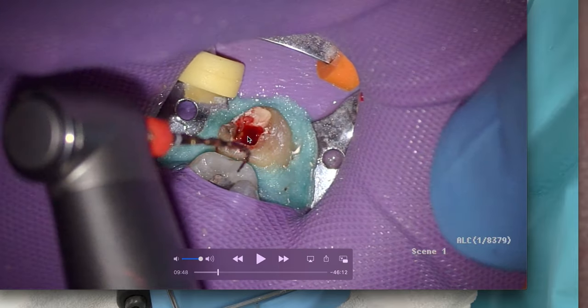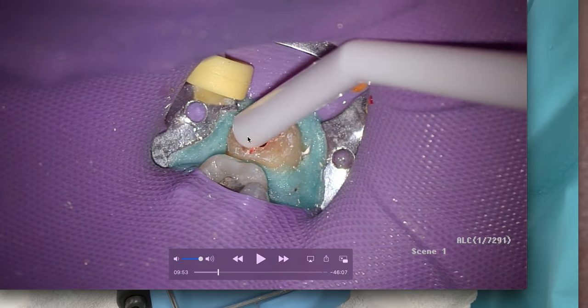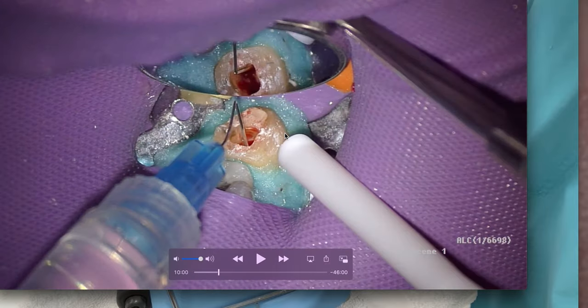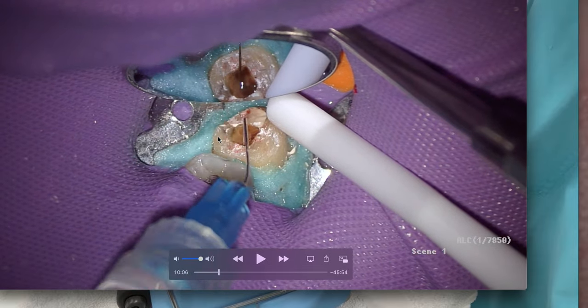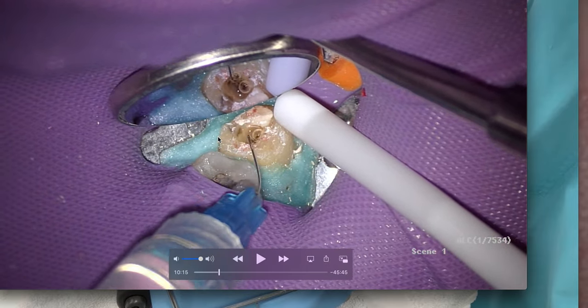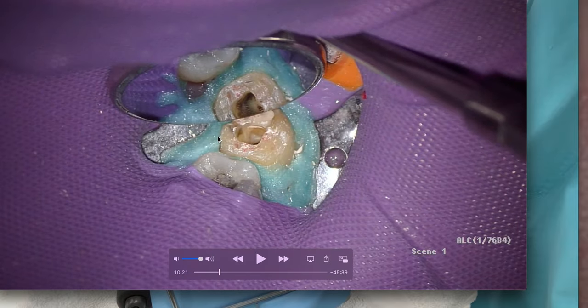I put a curve on it but I'm not sure it went in. So we're going to rinse that out. You can see again the rubber dam keeps the patient's saliva out of the tooth and keeps my irrigants in the case. After irrigating everything out, I can see I have two mesial canals right there.